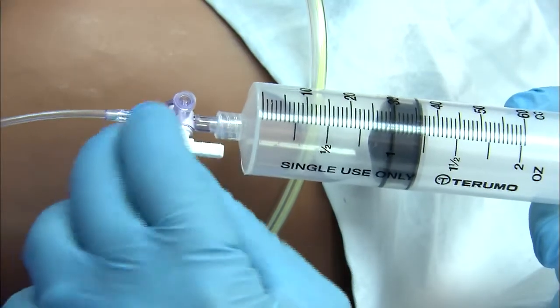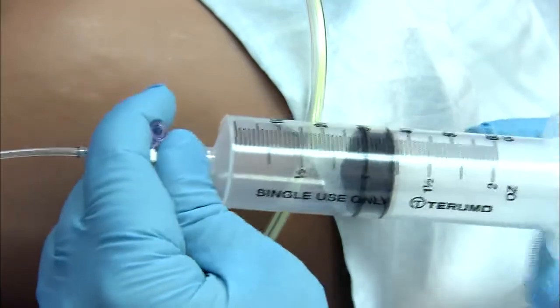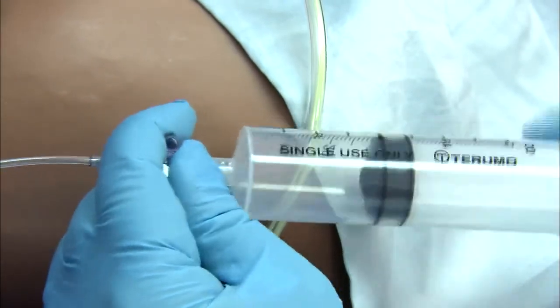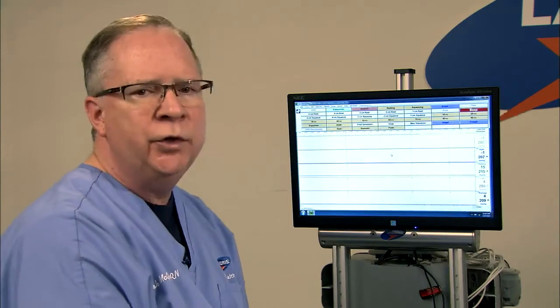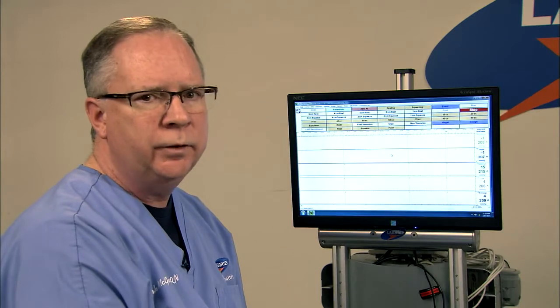You can go ahead and deflate the balloon. You can just take the syringe off and the balloon will deflate passively, or you can use the syringe and go ahead and aspirate the air out.